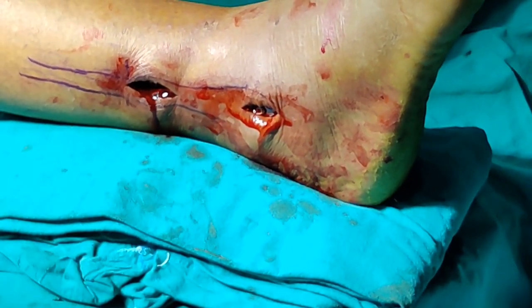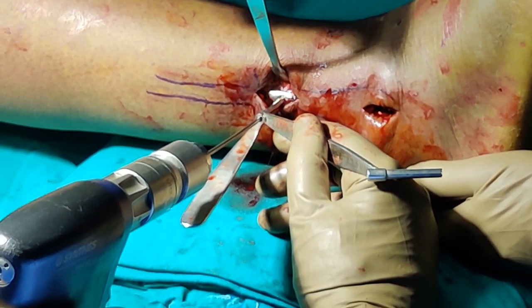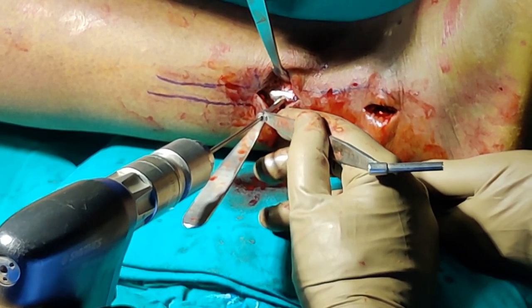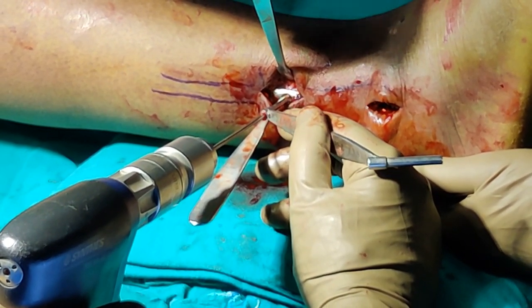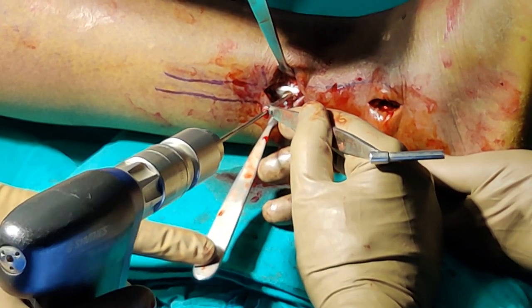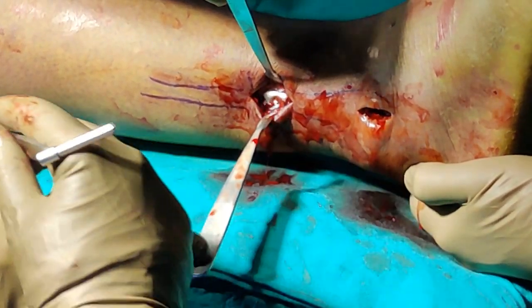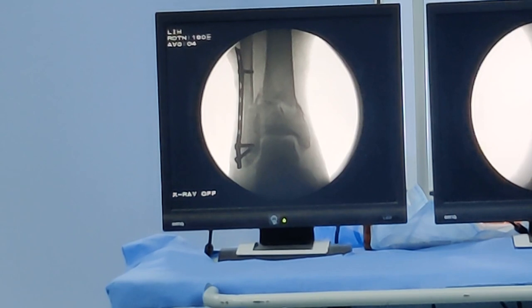So again, let us have an 18mm screw. In order to gain fibular length, my assistant is applying longitudinal traction so we have gained length while I drill. Measure the length and use an appropriate size screw. We have put one screw proximally — size 14 looks okay. If you look at the ankle mortise it is congruent, there is no talar shift and no talar tilt, so we have gained the length. Now it is just a matter of filling the rest of the screw holes.